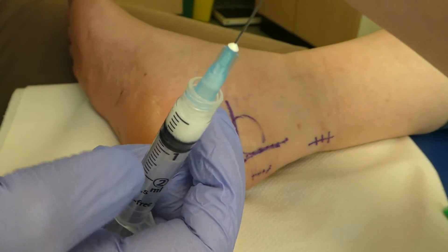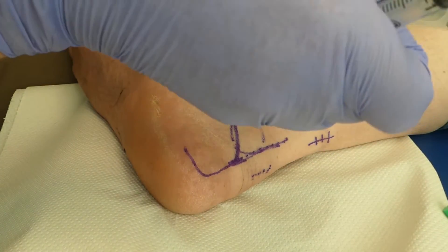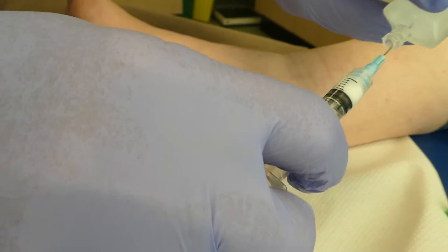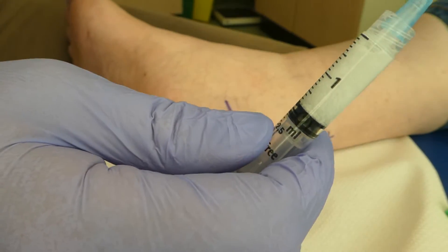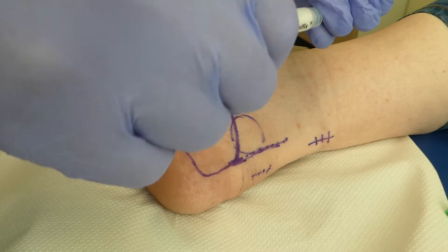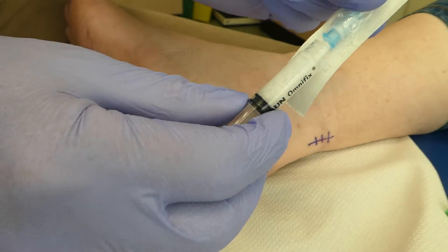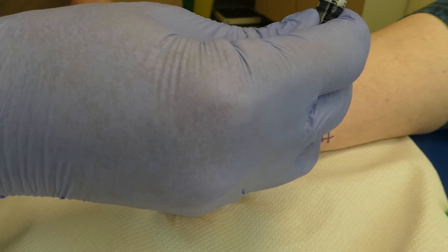This is where it becomes a little bit more art than science. I'm going to dilute that with some local anaesthetic. Why do I do that? Well, it dilutes the injection and allows it to spread out a little bit more. We get a diagnostic effect from the local anaesthetic, and it also means she's less painful afterwards. We don't resheathe needles in the conventional sense — that's just a nice quick way of resheathing. Then a separate needle for the injection: green to draw with ideally, and I like a blue 23 gauge to inject with. So there's our injectate.